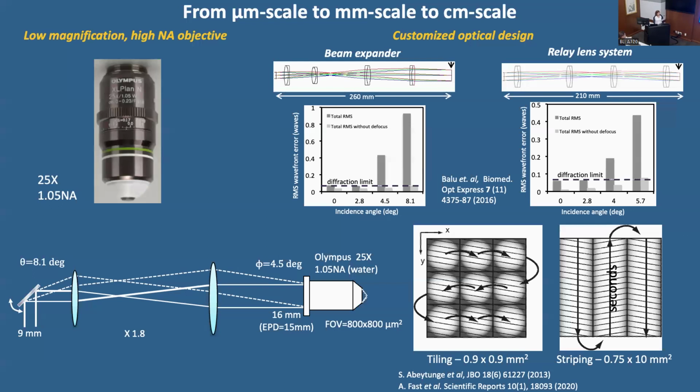Yeah, so again, there are lots of details going on. Usually, remember, we started with two lenses that are generally sufficient to do your job. But once you start scanning these large angles, you introduce optical aberrations. I'm not sure how familiar people are with spherical aberrations. You definitely introduce with these types of optics astigmatism, coma.